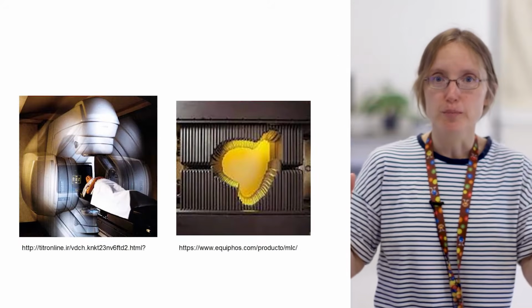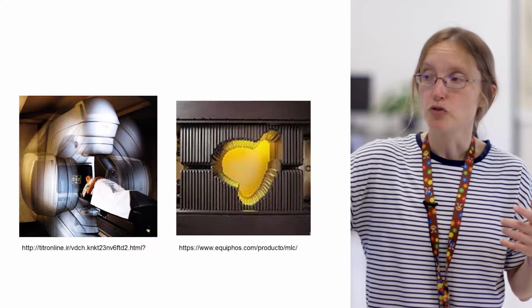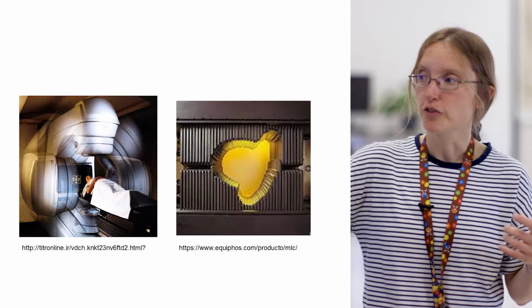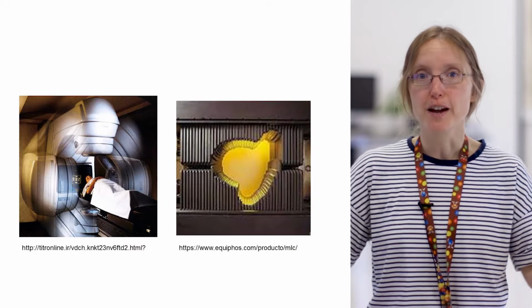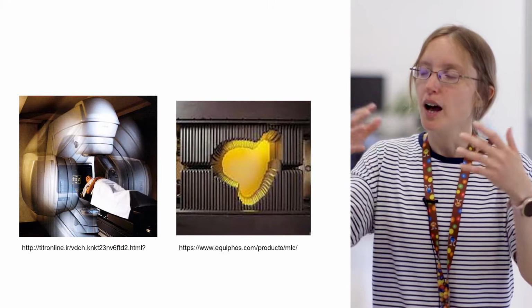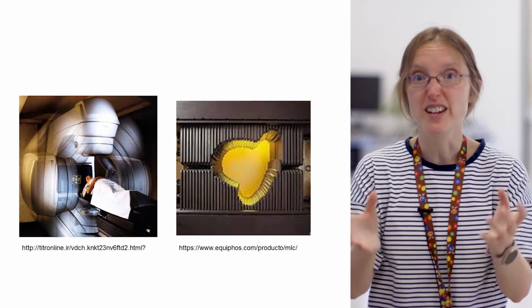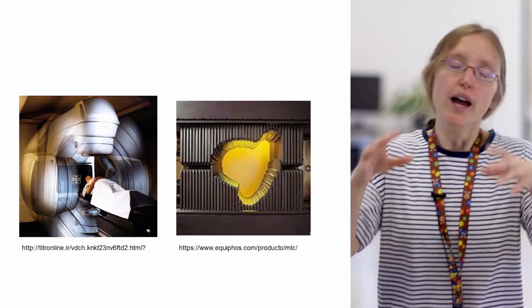As an example, here's a bit of a mock-up. The patient's on the bed, and the radiotherapy linear accelerator moves round the patient. Radiotherapy is delivered from multiple different angles, thereby focusing in on the tumour in a roughly central point, so that maximum dose goes to the tumour and the dose elsewhere is spread out or minimised.